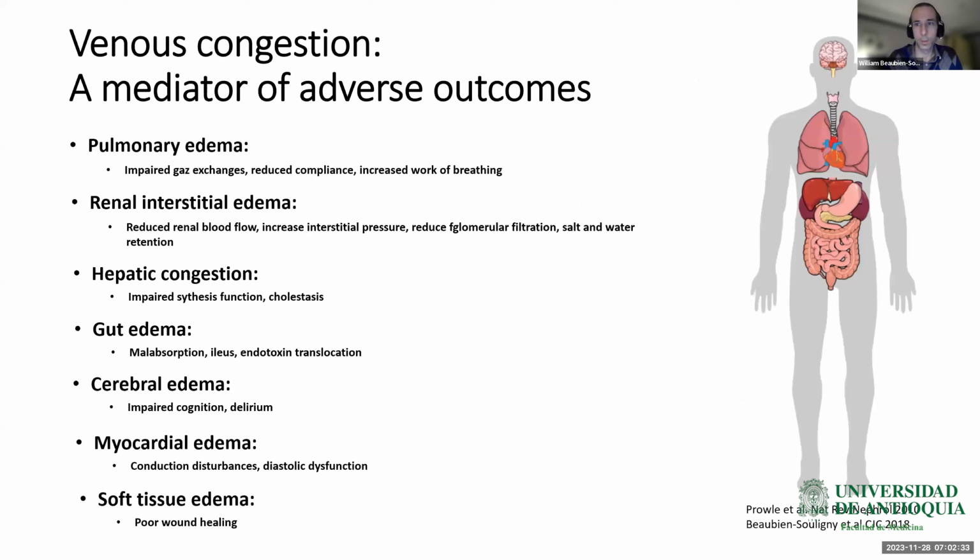We designed a prospective cohort study to investigate the significance of femoral Doppler in cardiac surgery. Our study protocol is presented here, where a Doppler assessment of femoral vein was performed before surgery and post-op day 0 and post-op day 1, with outcome measured at day 28, with 150 patients included. So we analyzed the femoral Doppler as follows.